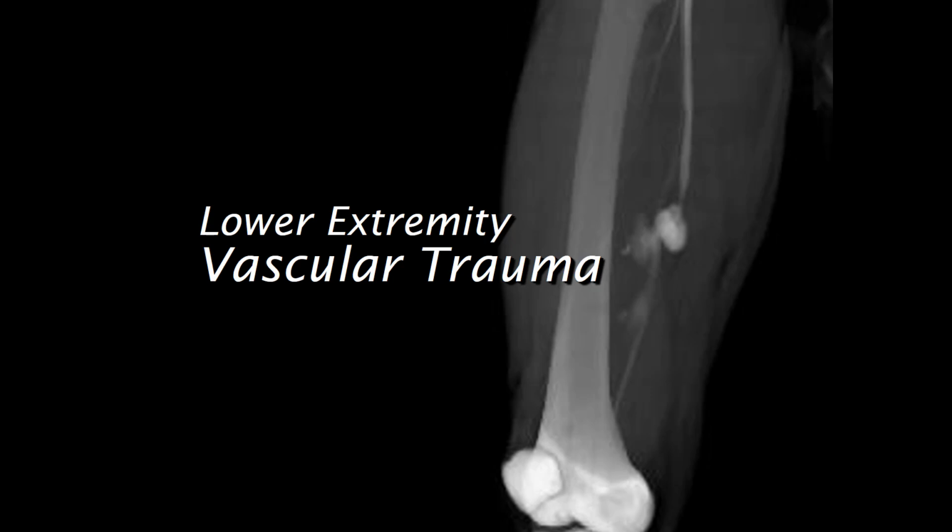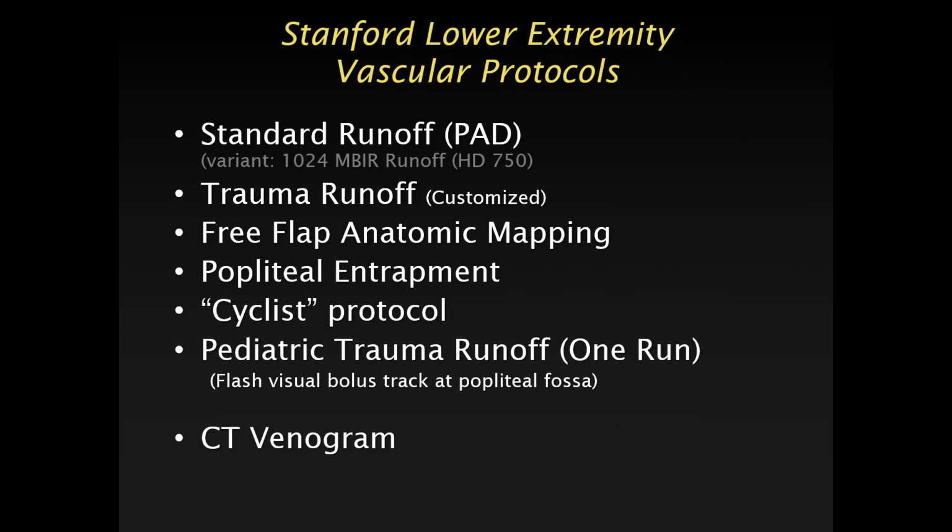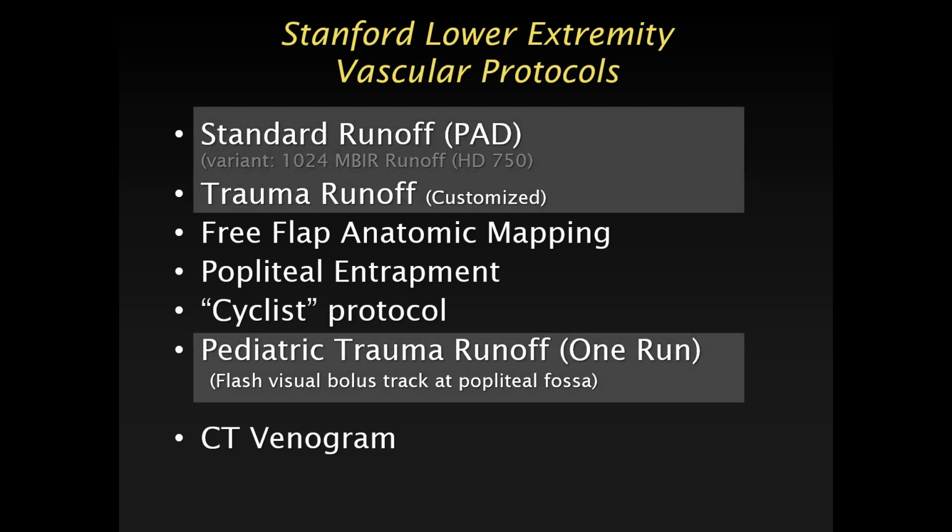protocoled not ideally, and that's a lot of responsibility also on the technologist side, because the technologists actually see the patient and they really know what the lesion is by just looking at the patient. So the background to that is that when you pick just a standard runoff protocol, and we have essentially 3 runoff protocols that would fit in this context.